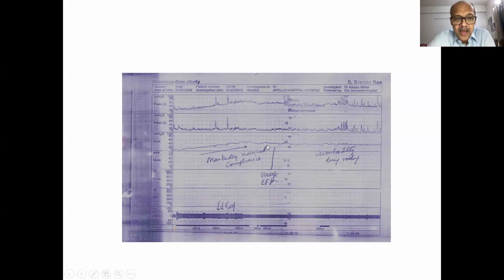Okay. And so this is a reduced capacity, poorly compliant bladder. And you can see the end filling pressures are very high. And when the patient tries to pass urine, there's an acontractility. It's trying to strain with his abdomen, is not able to pass. There's no detrusor pressure. So small capacity, poorly compliant acontractile bladder with unsafe storage and resulting secondary chronic kidney disease.